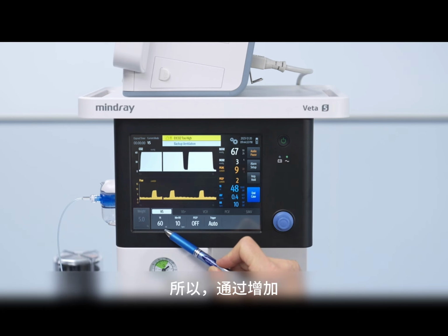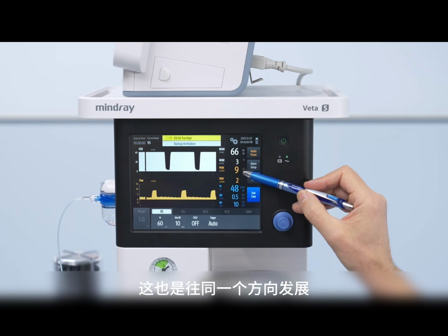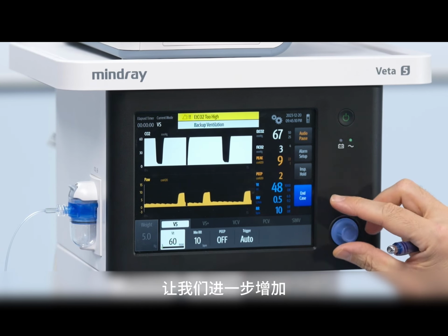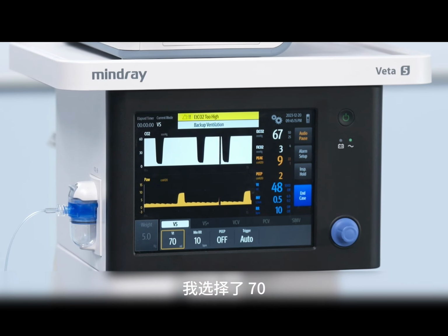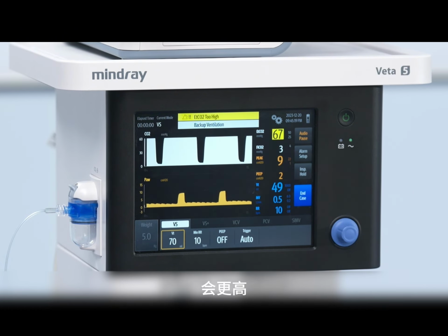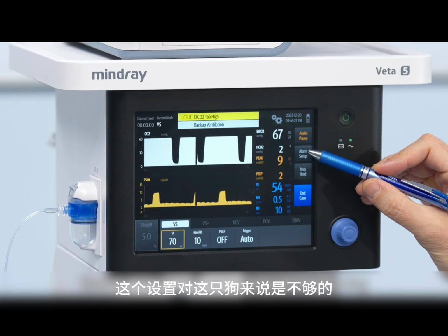So by increasing our desired tidal volume, the animal responded with a higher peak inspiratory pressure, which moved in the same direction. So I think that's okay for now. Let's increase it further because the end-tidal CO2 is rather high. I have chosen 70, and let's see if the pressure is going up even higher. By experience, I anticipate that this setting will not be enough for this dog.